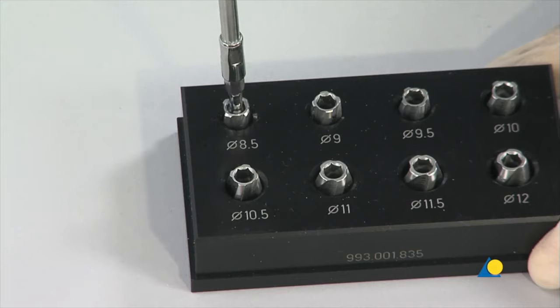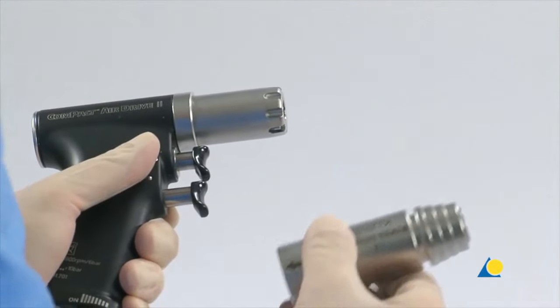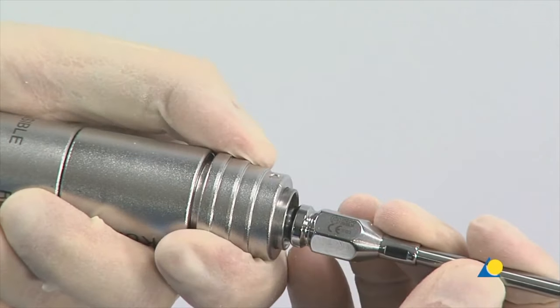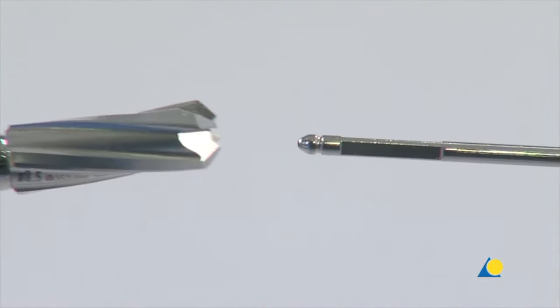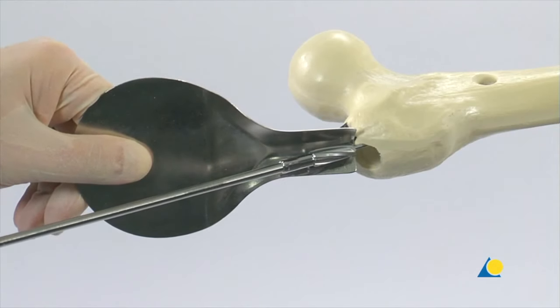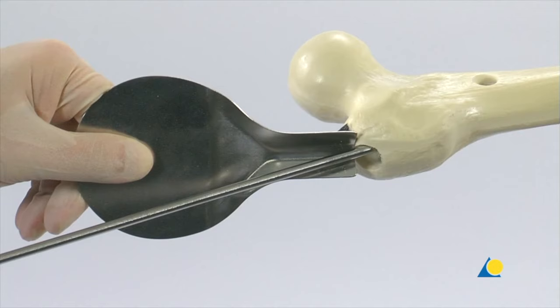Reaming begins with the 8.5 mm reamer head. The reamer head is attached to the flexible shaft. The compact air drive with the attachment for medullary reaming is now employed. By pulling back the ring on the quick coupling, the attachment is opened and the flexible shaft can now be inserted. The reaming assembly is guided over the reaming rod. During the reaming process, the reaming rod is held precisely in the axis of the femoral shaft by the assistant, using the holding forceps to prevent the rod from rotating and the reamer from jamming. In clinical practice, the tissue protector is used during the entire reaming process.